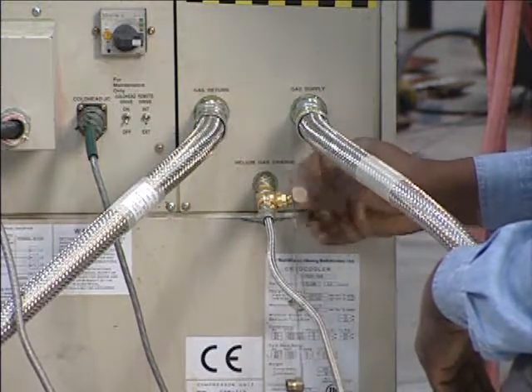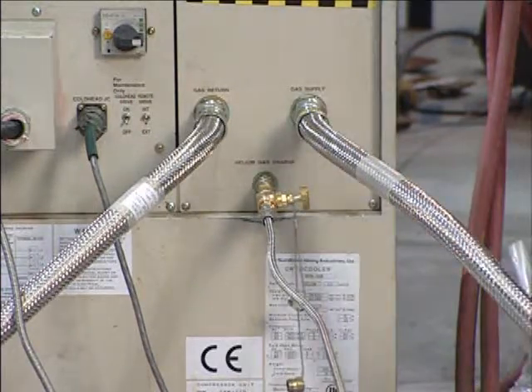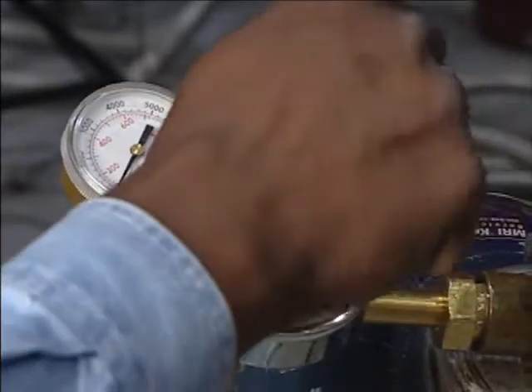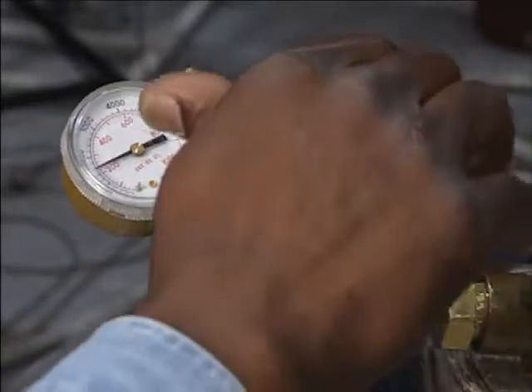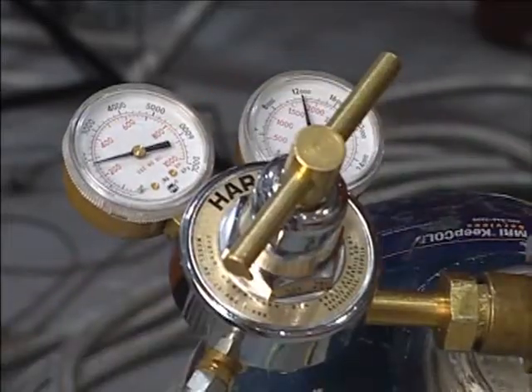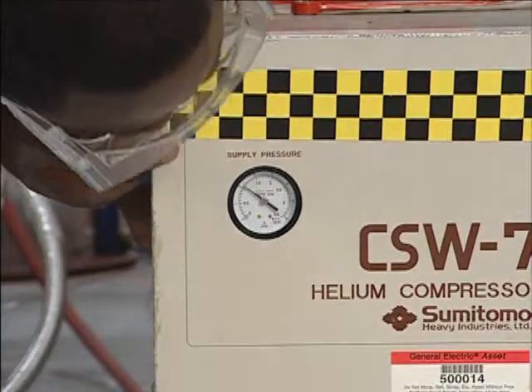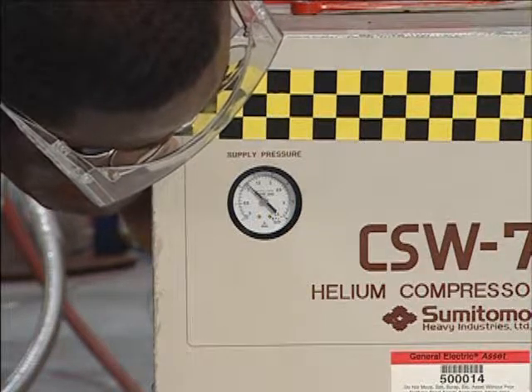The compressor is now ready to be charged. Adjust the low pressure gas valve on the helium bottle, charging the gas line and fittings. Now open the charging valve while watching the helium gauge on the front of the compressor.